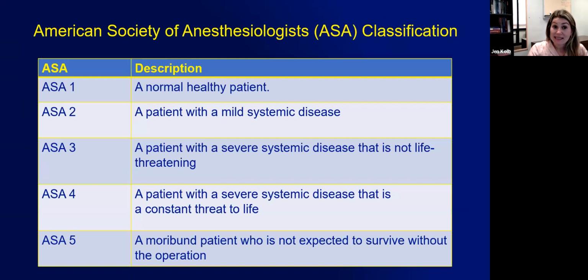In terms of how we assess patient risk and comorbidity, every clinic has a slightly different setup, but there are two different ways that you can do a colonoscopy or an upper endoscopy. One is by having the GI doctor do anesthesia, something called conscious or moderate sedation, through the IV. And the other is when we set these cases up with the assistance of anesthesia. And a lot of that comes down to how healthy or how sick your patient is.